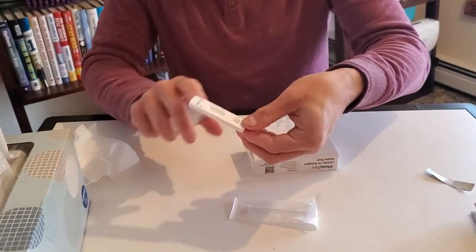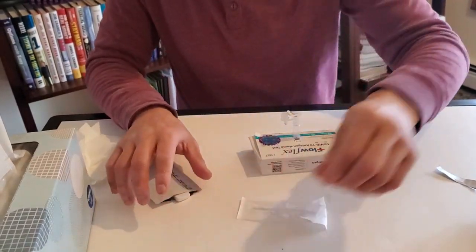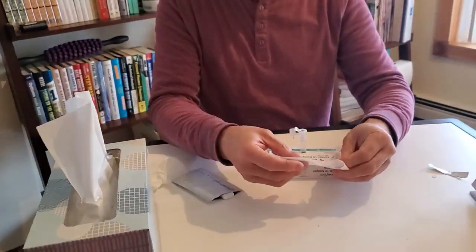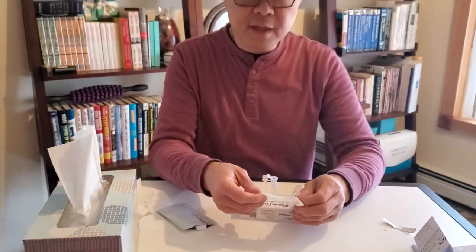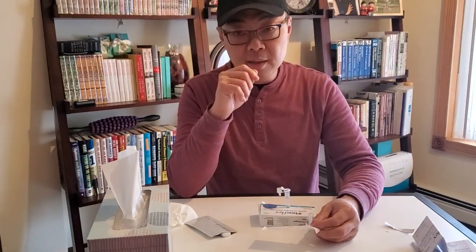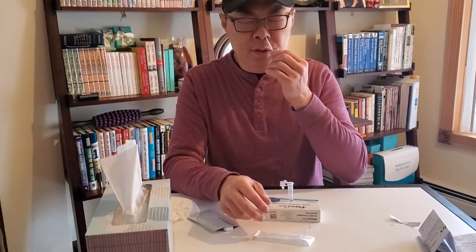This is the tester, and this is the well where you're going to put the drops. According to the instructions, you basically put this in your nostril and you swab it five times each. It goes in about one inch or 2.5 centimeters — five times around each nostril.